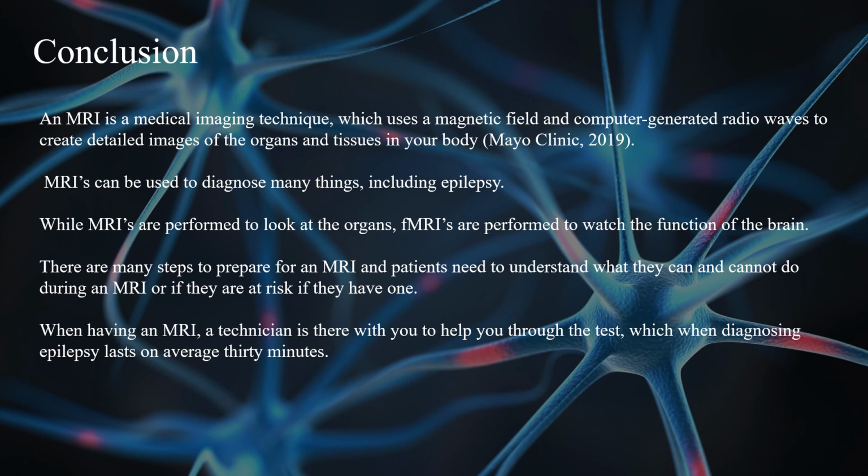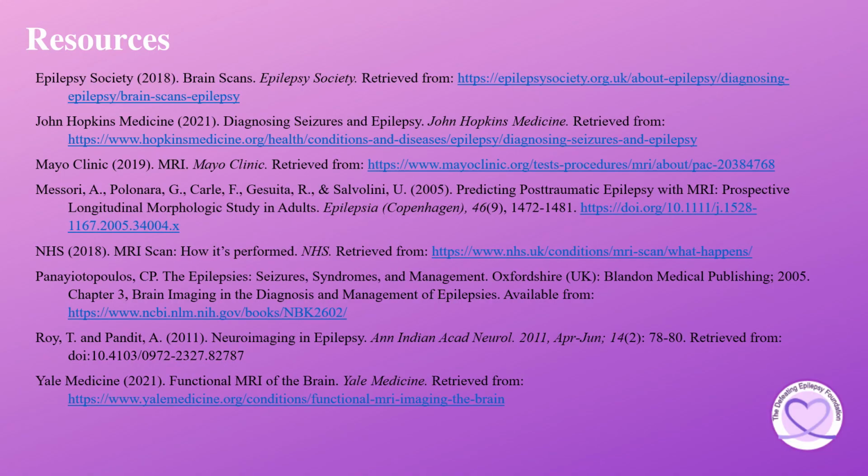There are many steps to prepare for an MRI, and patients need to understand what they can and cannot do during an MRI, or if they are at risk if they have one. When having an MRI, a technician is there with you to help you through the test, which when diagnosing epilepsy lasts on average 30 minutes. To learn more about MRIs and epilepsy, please check out the resources used in the presentation today.